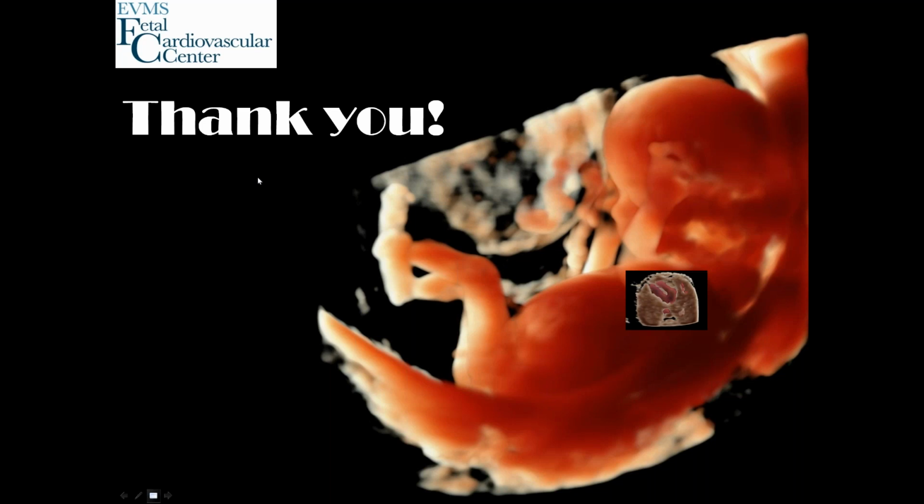As you know, we can use it briefly, and we always look at the 2D alone, and if something looks abnormal, then we can use color. If something abnormal appears on your 2D image, it's already justified that we take another look, because it's definitely going to be beneficial for the patient. But again, the evaluation with Doppler should be very short. You need to monitor the thermal and mechanical index, and your machine should be preset to the lowest exposures for the first trimester scan anyway. And the use of color is not that high intensity in comparison to spectral Doppler.